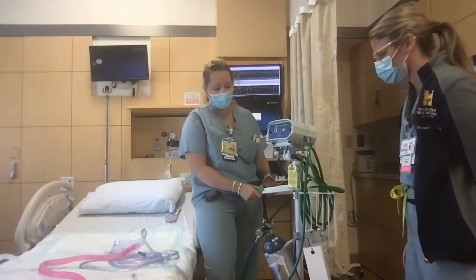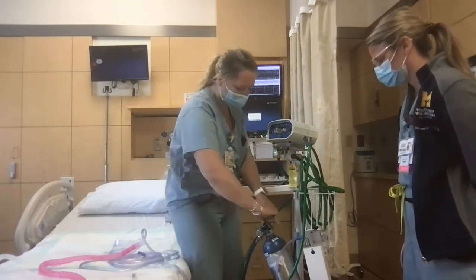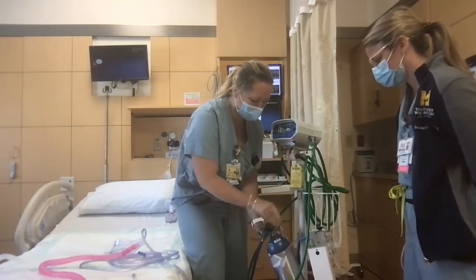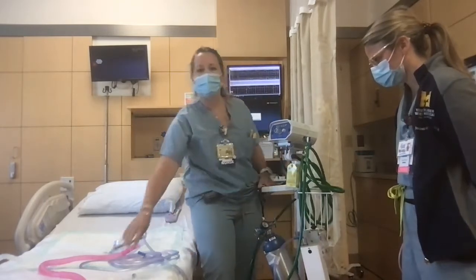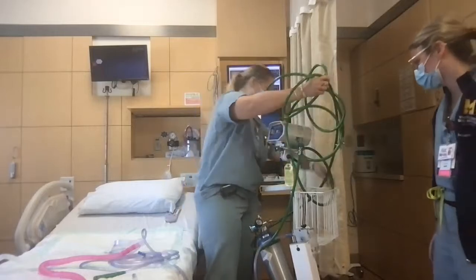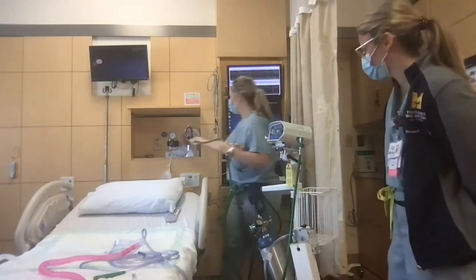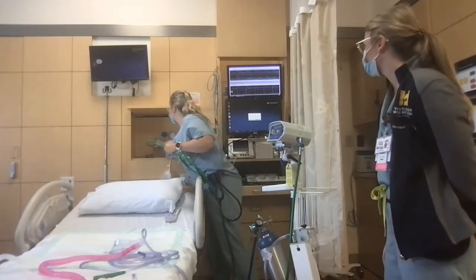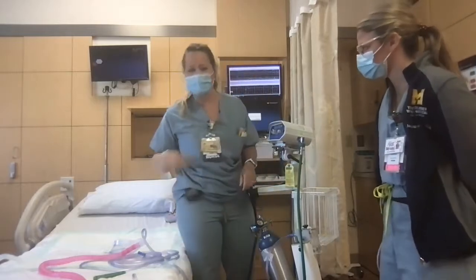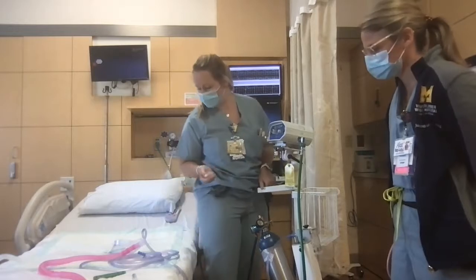When I get to the patient's room, the first thing is that I can turn my nitrous tank on. The nitrous tank is now on, and I can now hook it up to the oxygen, which is the out. That noise is normal. You can hear it one time. If you continuously hear it, that means that your tank is either off or that it's empty.